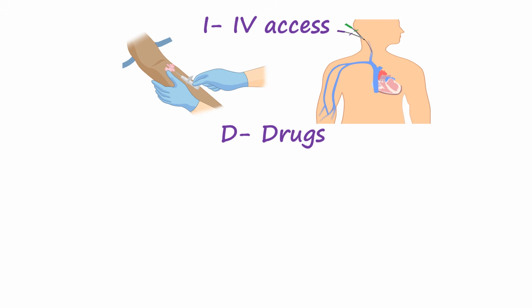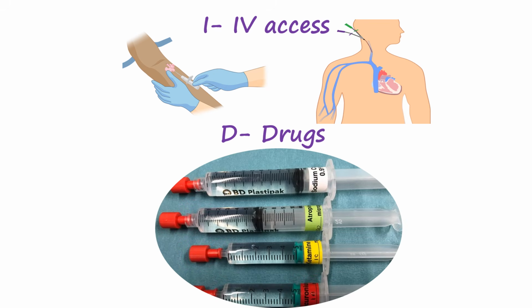All the drugs should be prepared and labeled, including an induction agent like etomidate or ketamine, neuromuscular blockers such as succinylcholine or rocuronium, and any adjuncts like fentanyl or lidocaine, ensuring doses are calculated and drawn up to avoid delays during critical moments of intubation. Along with this, emergency drugs like atropine, adrenaline, and other inotropes should be prepared.